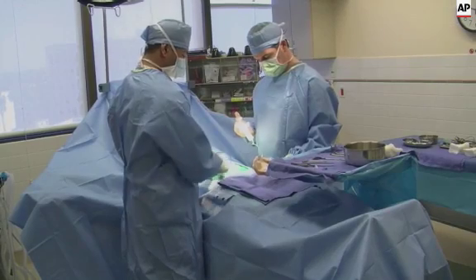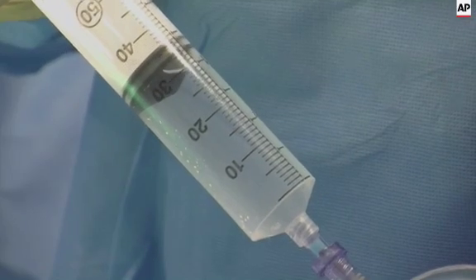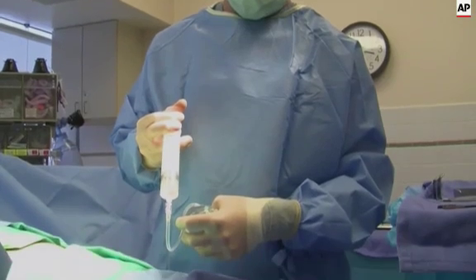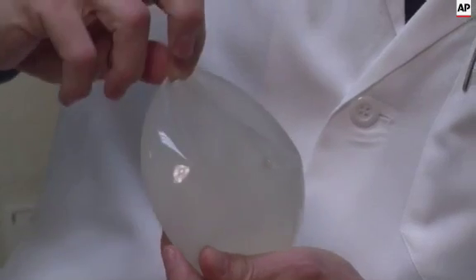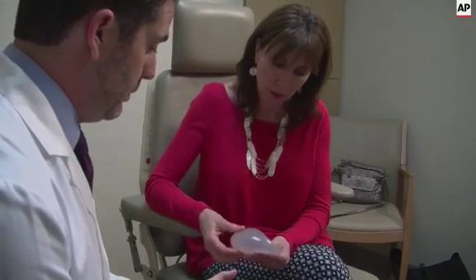It's about... What is it? Shells of the implant, and there's one within another within another. If you look very closely, you can see the other shells within the shells. Right, which is the whole baffling system. The saline or silicone for that matter. Yeah, feels great.